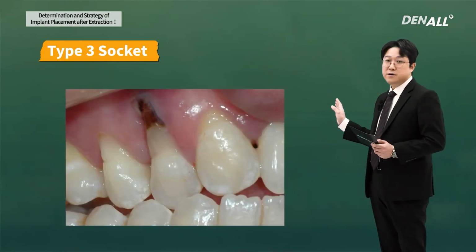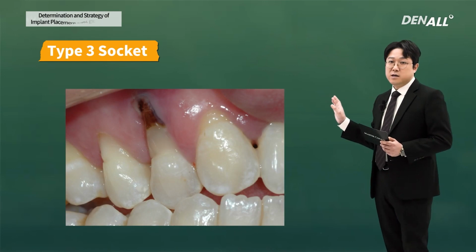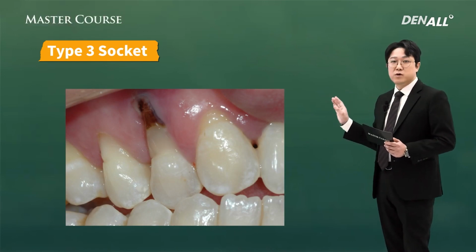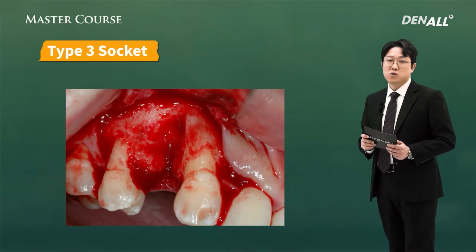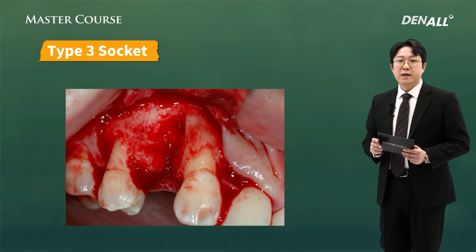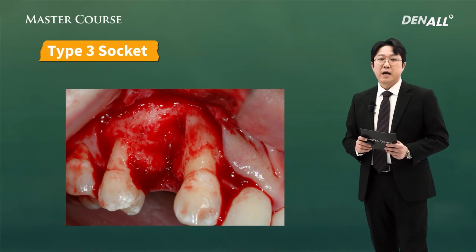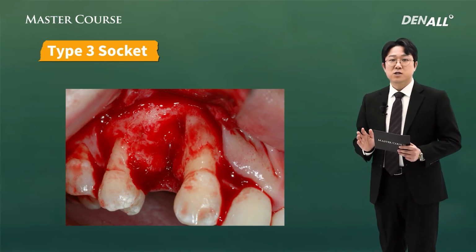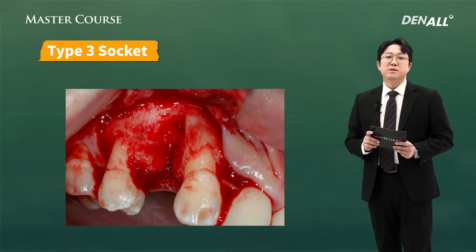This is the situation. In number 14, there's soft tissue resorption buccally. When I open the flap, there's also bone resorption. So I'm going to complete my explanation about extraction sockets. I'm going to talk about the treatment strategy for each case in the next lecture as we look at clinical cases.